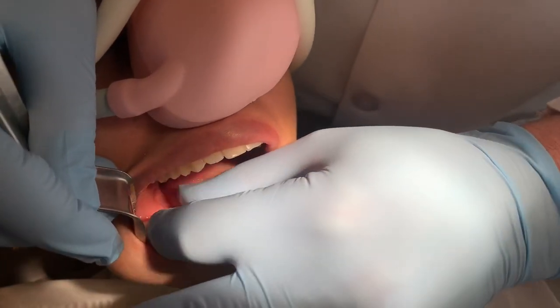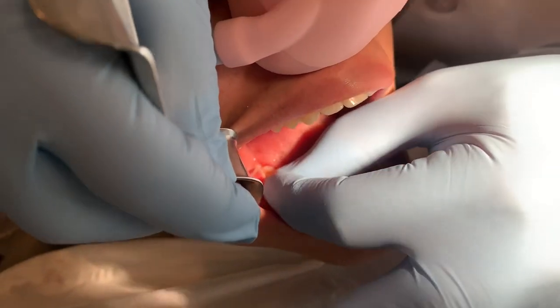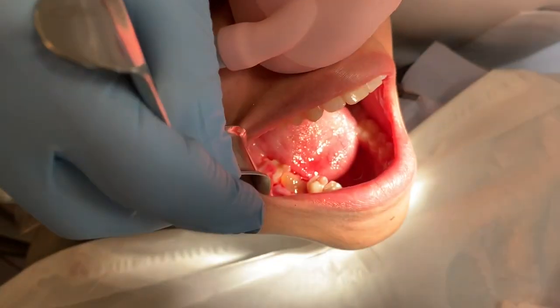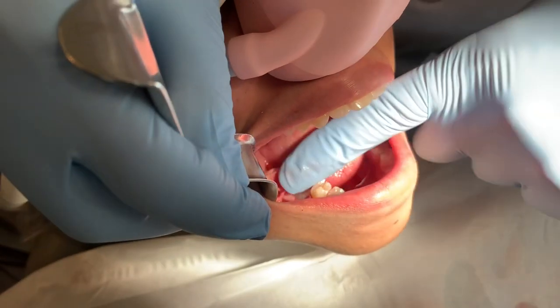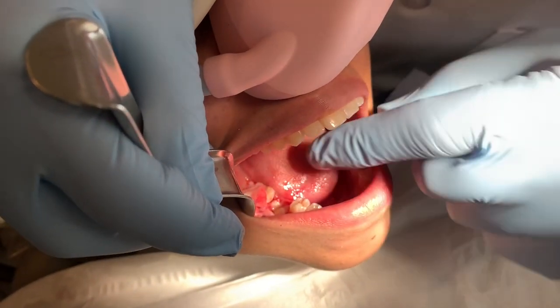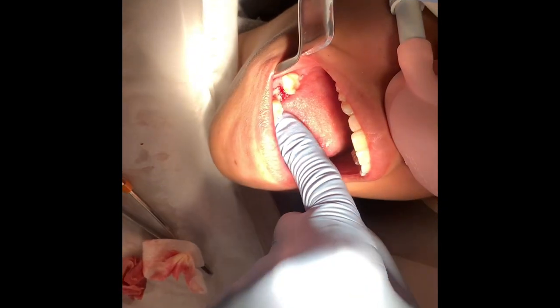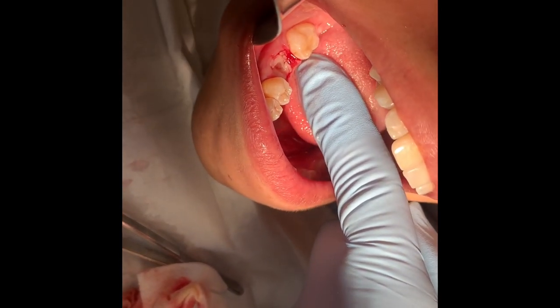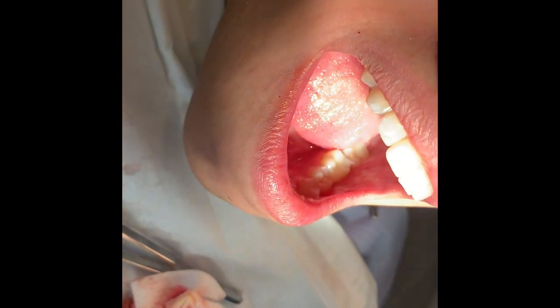It's going to seem like it really isn't going to want to go in there. But I've trained my fingers to really get it going in the right direction. And then when you get it near in there, you can start pushing it with a little bit of cotton. You'd be surprised how much this stuff will fit in here. Okay, this is what the site looks like once we have the platelet-rich fibrin in there. So you can see the sites are totally filled with the fibrin. And all we have left to do at this point is go ahead and apply a couple stitches.